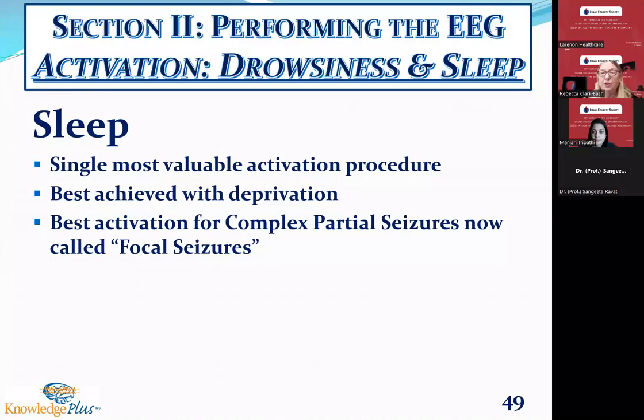Now, the other thing I like to do is have some kind of sound masking device so that the patient doesn't hear any noise outside of my EEG room. We had 7 EEG rooms. The floor was tile, so if anybody walked down that hallway, it would wake our patients up. So if you just have some nice music, classical is very nice. You can even use Pandora or Spotify on your phone to play some music at a tone louder than you normally would to mask all of the noise outside of that EEG room.